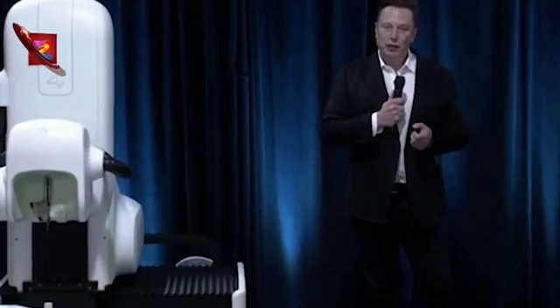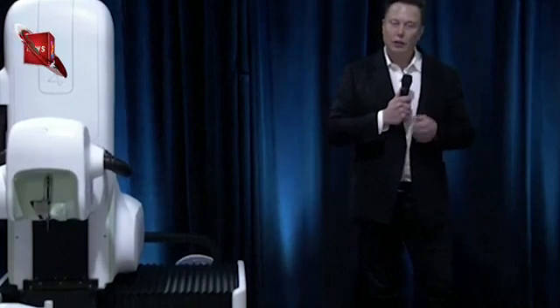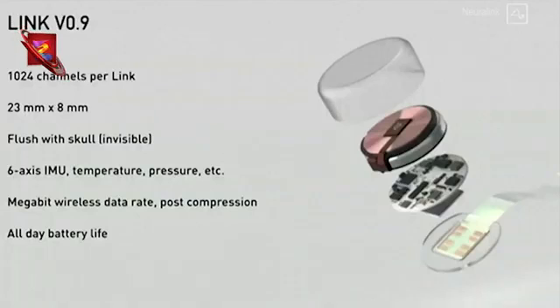It's more complicated than this, but in a lot of ways it's kind of like a Fitbit in your skull with tiny wires. And it's also got all the things that you would expect to see in a smartwatch or a phone, like inertial measurement, temperature, pressure.